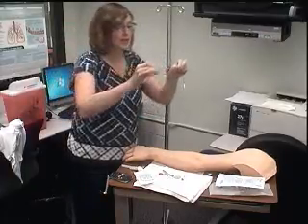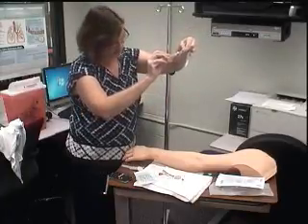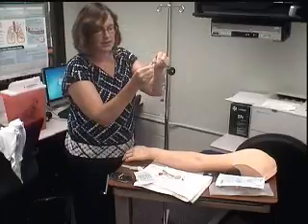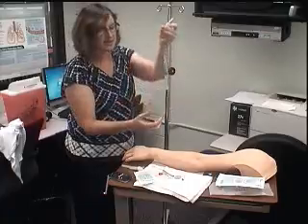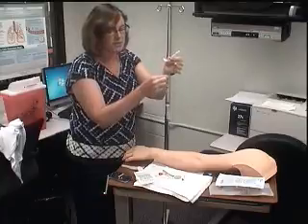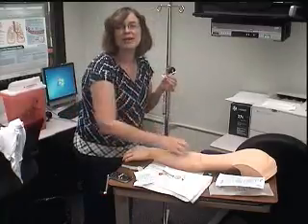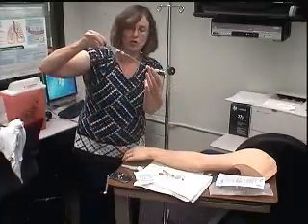Once I get this, I connect it to the saline lock, push it, put it in, twist it, and then I loosen this up just a tiny bit so that when I prime it, my saline goes all the way to the very end. I want this to be filled with saline because I don't want to hook it up and not have any saline in there. If I do that, I would actually get air into my vessels. We don't want air in our vessels. So this needs to be primed all the way.